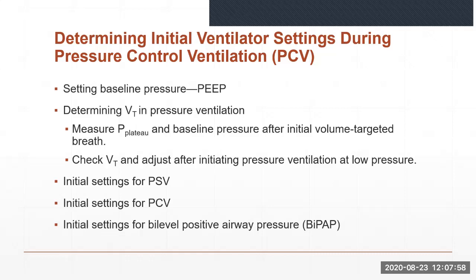Usually, pressure support ventilation is started after the patient has been on full ventilatory support and is being changed to partial support to begin the process of discontinuing ventilation. Pressure support ventilation, or PSV, is used to support spontaneous breaths in a patient with an artificial airway when IMV or spontaneous or CPAP modes are used. The pressure is set at a level sufficient to prevent a fatiguing workload on the respiratory muscles.